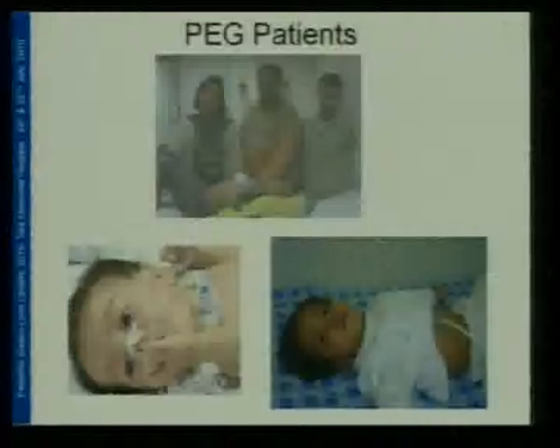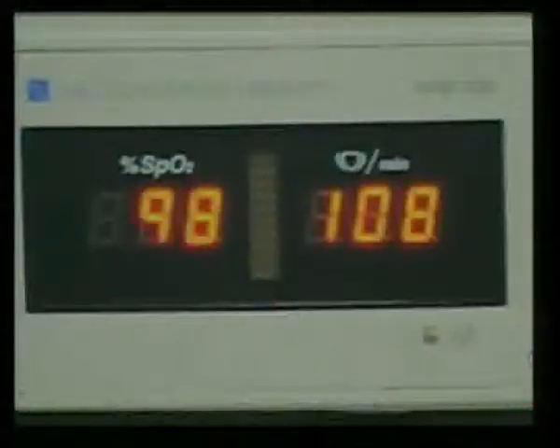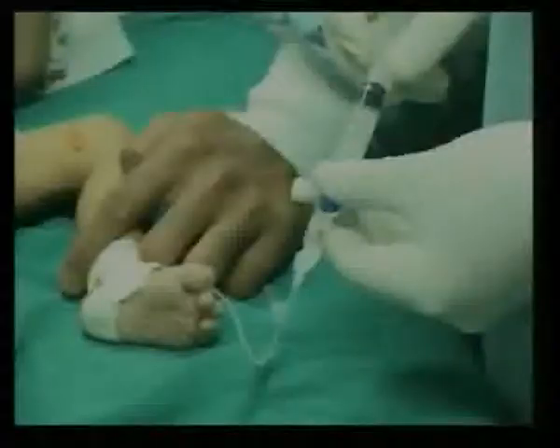A lot of children that we've done, that's what I'm trying to show in the photographs. And I'll end with a video, please. So that was a small child. As you can see, most of them, like this child, are on tracheostomy, there are issues and swallowing is not there, so I had to give it for this. You would obviously want just a partial sedation. You need a good team of people there.